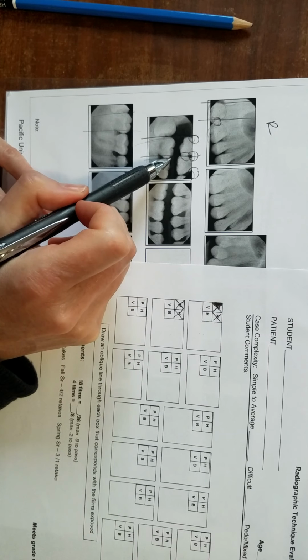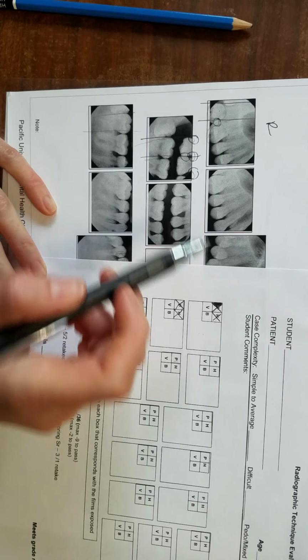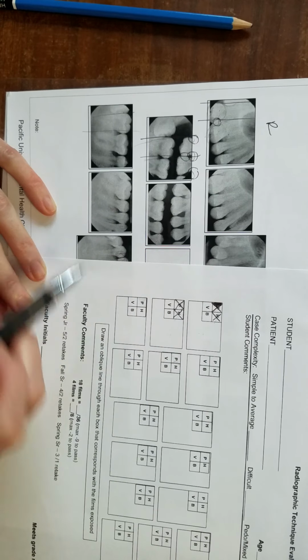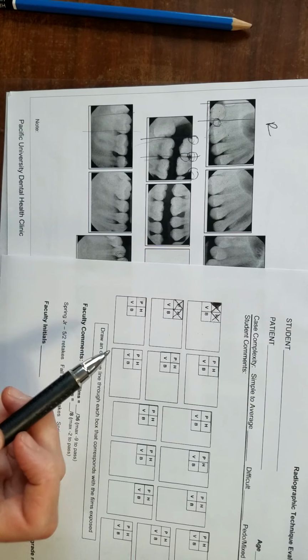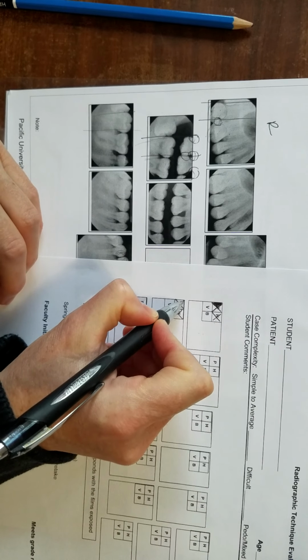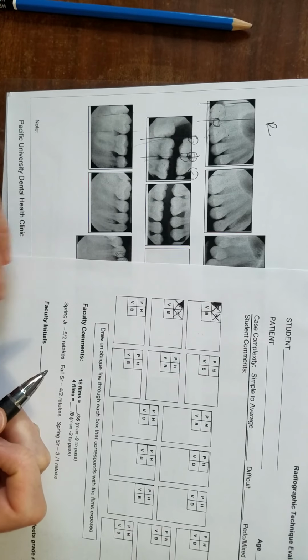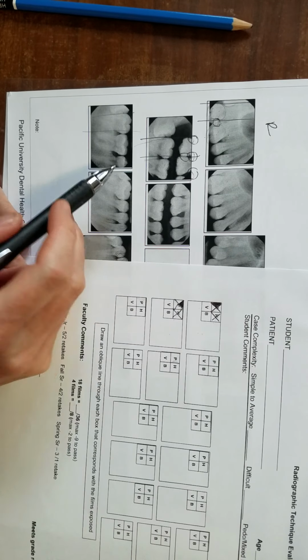And the patient isn't biting down all the way, so if they had bit down, we probably could see up there a little bit better. And we want to move it up a little bit. The patient has to bite a little bit better, and we need to move it up a little bit so that we can see that alveolar crest. And that's how you critique it.